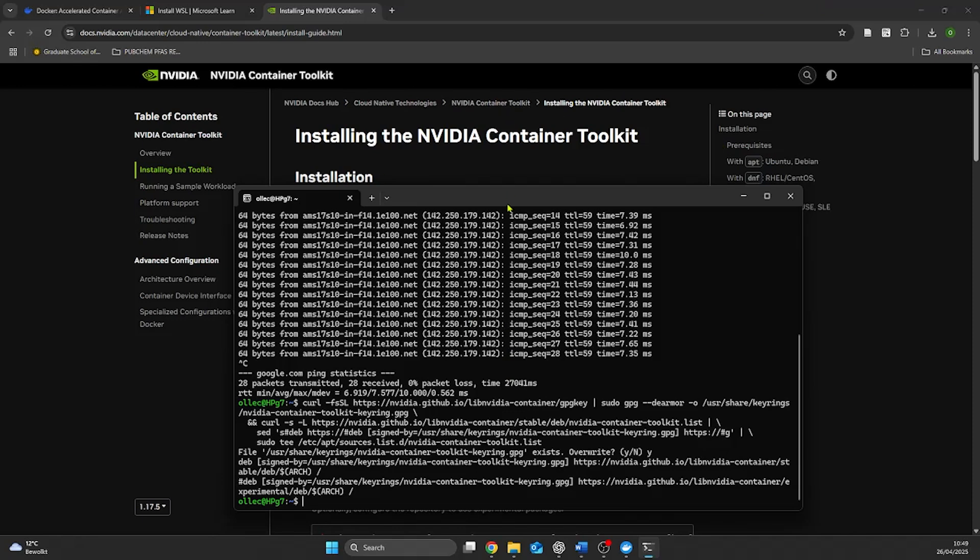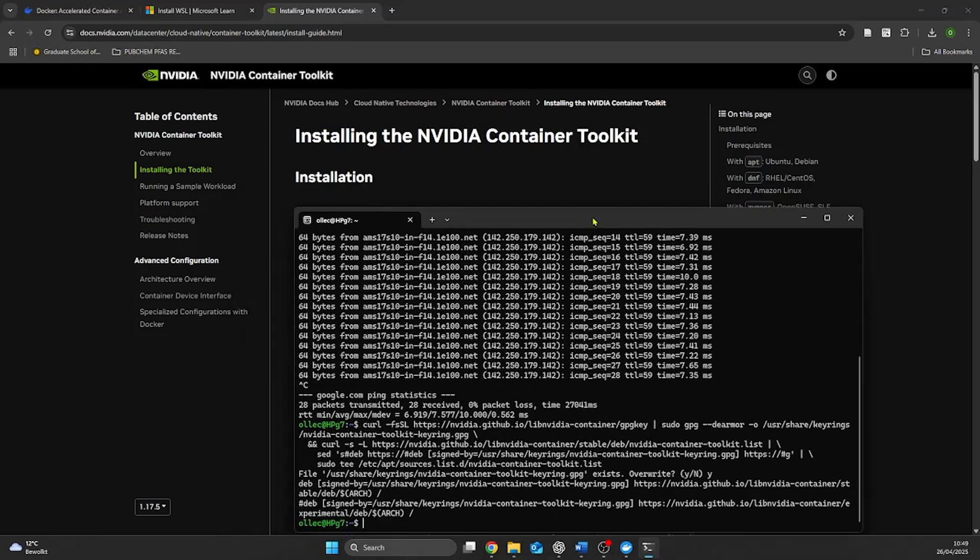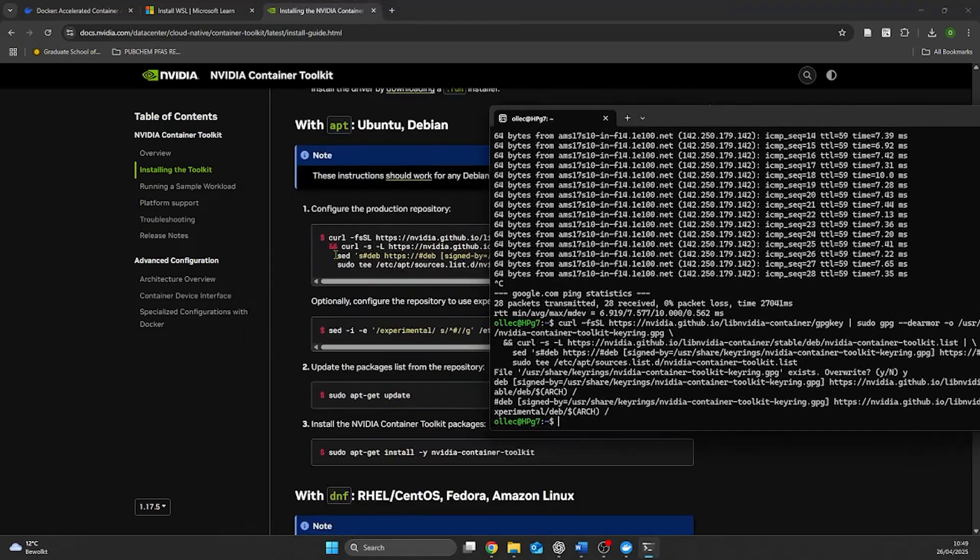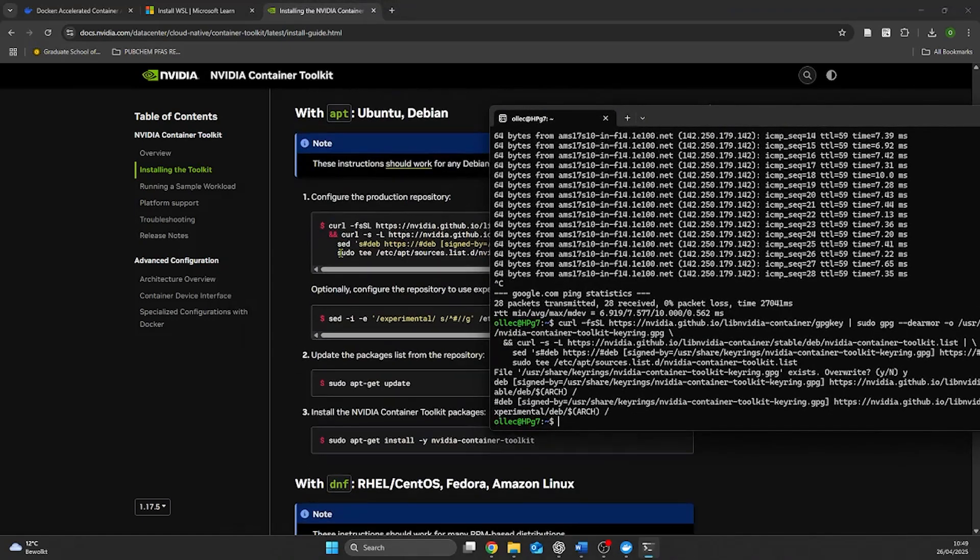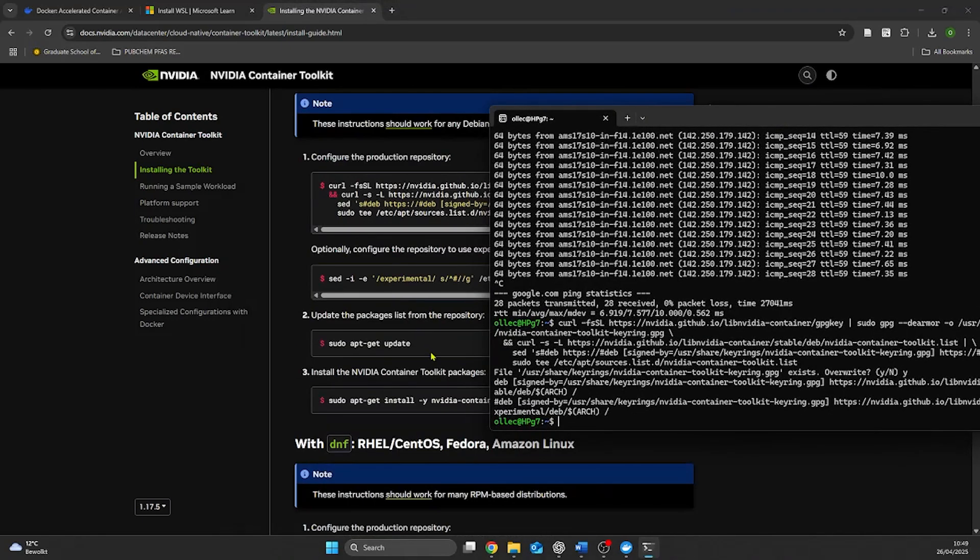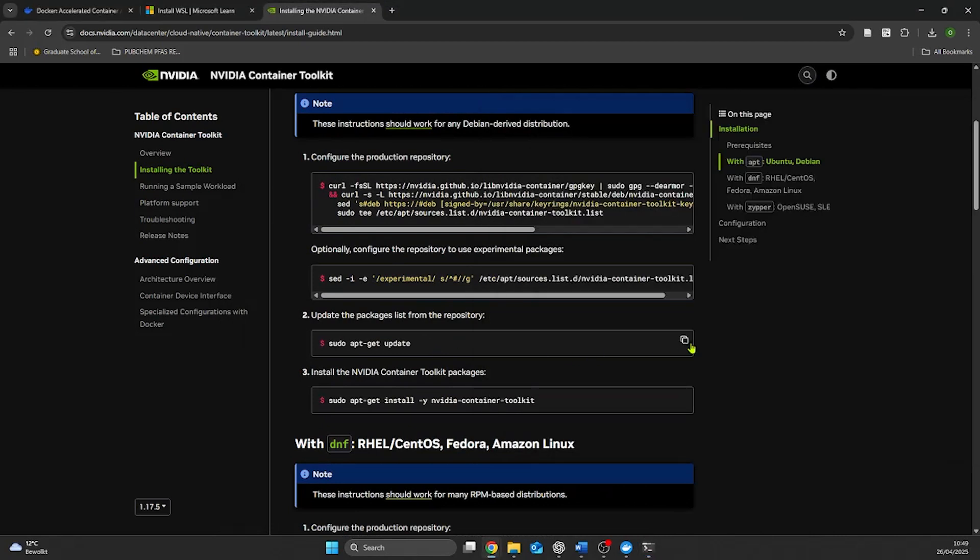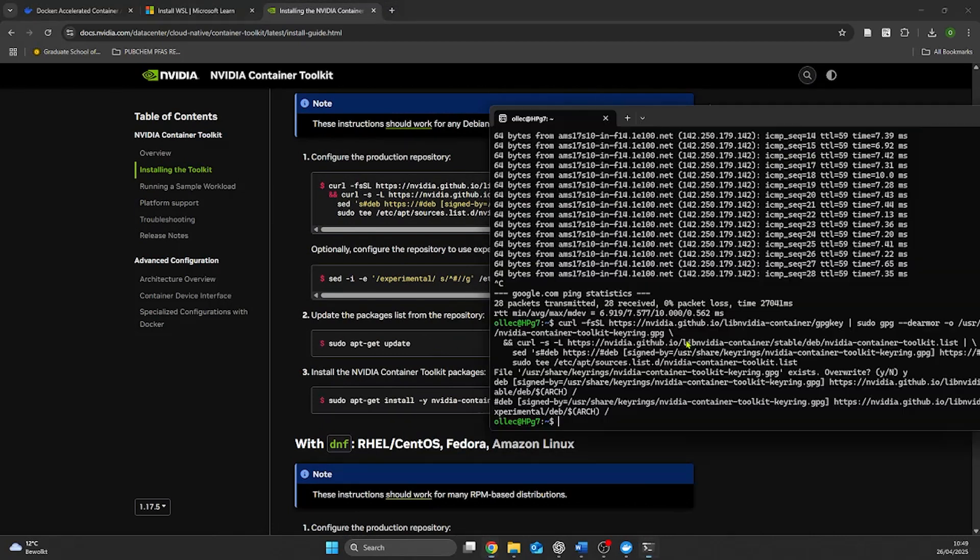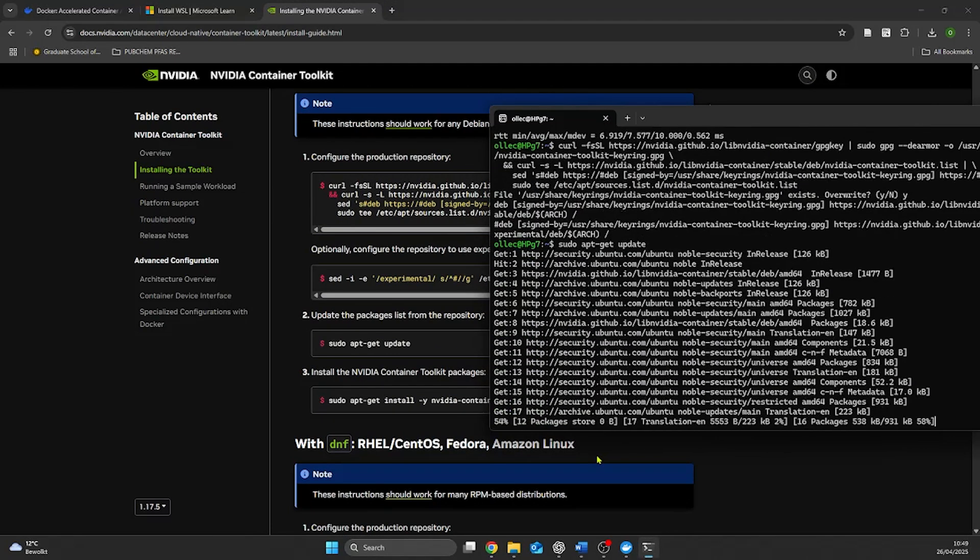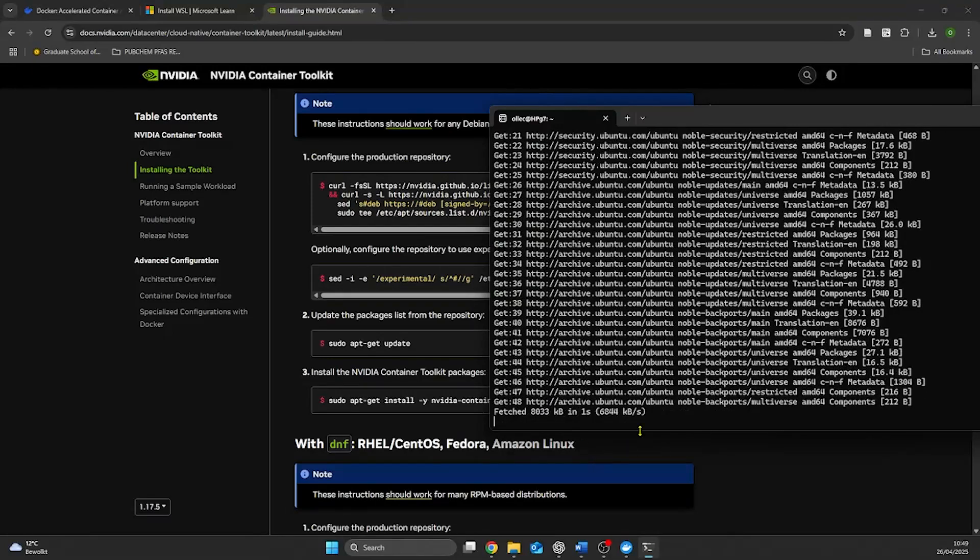We then continue running our codes for installing the NVIDIA Toolkit. We continue installing from the NVIDIA Toolkit install guide where we configure the production repository, we update the package list and we install the toolkit.